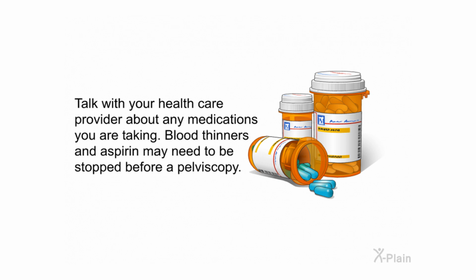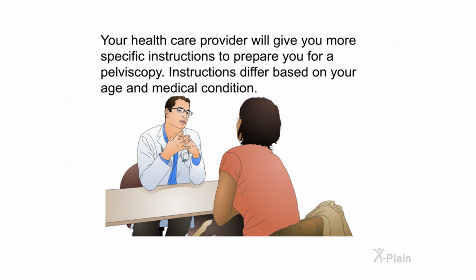Talk with your healthcare provider about any medications you are taking. Blood thinners and aspirin may need to be stopped before a pelviscopy. Your healthcare provider will give you more specific instructions to prepare you for a pelviscopy. Instructions differ based on your age and medical condition.